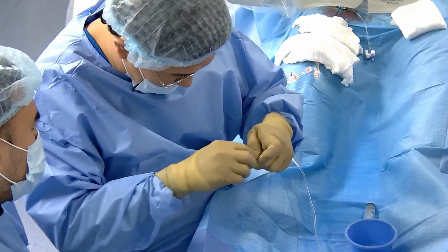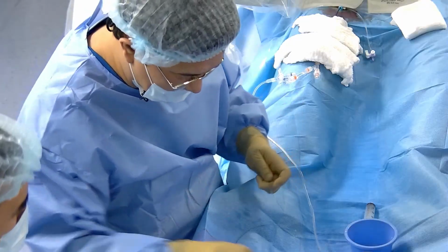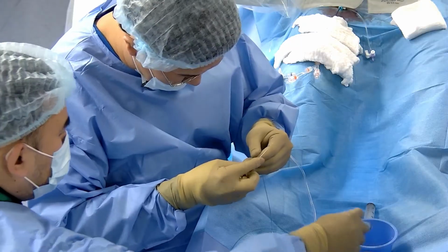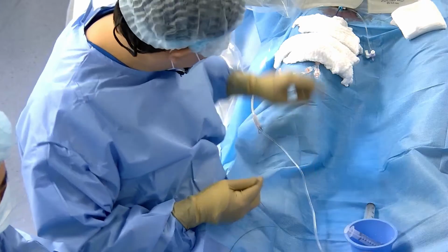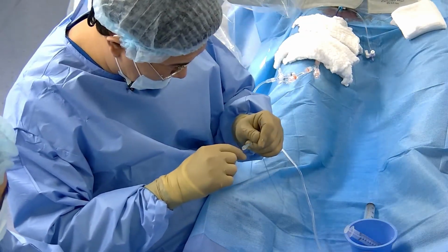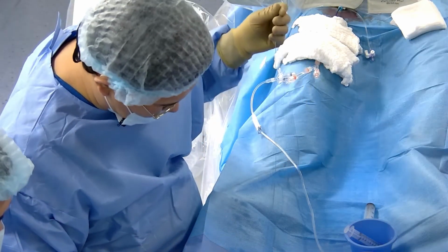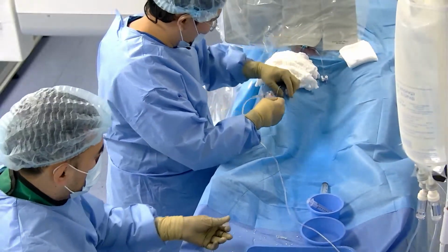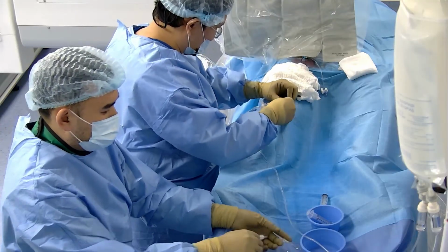Yes, we have a lot of problems with the instruments nowadays. Yes, we asked for the 8 French Kimny guide, which is Judkins right coronary, and then we took a Sonic 1.5 25. 25 is the only length available on the shelf today.